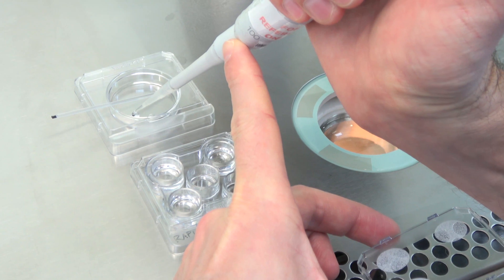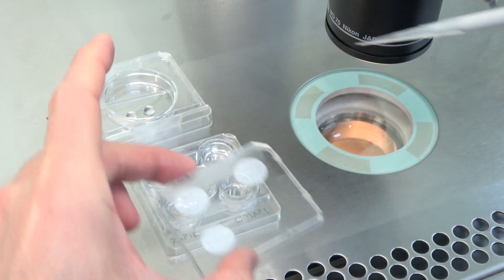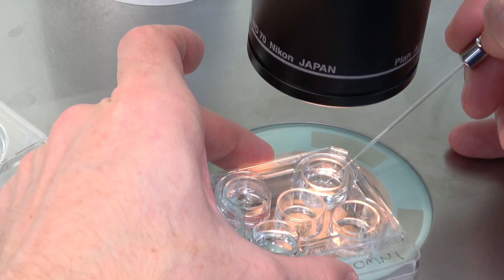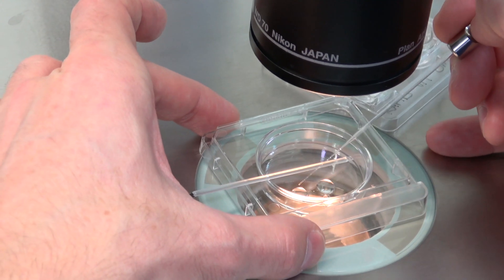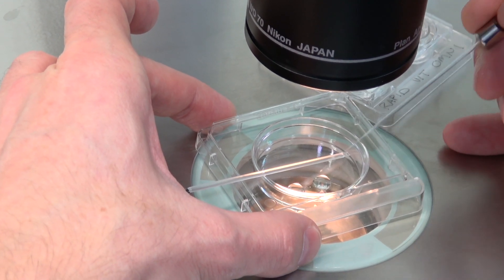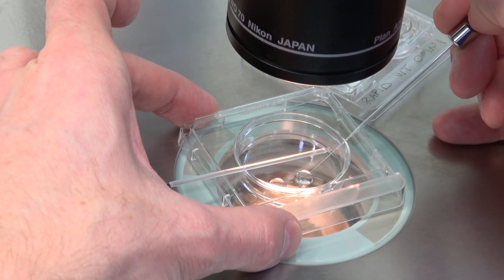When less than 30 seconds in the second solution remains, make two 50 microlitre droplets of the third solution on a sterile, non-toxic surface, preferably a culture dish. Prime the pipette with the third solution and move your oocytes or embryos into the first droplet. Expel the remaining media outside of the droplet and prime your pipette again from the second droplet. Immediately transfer the oocytes or embryos into the second droplet.